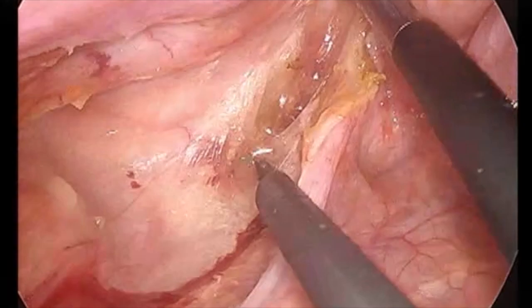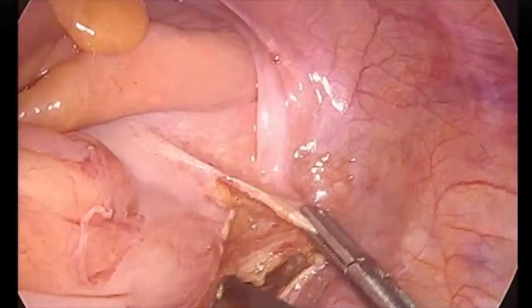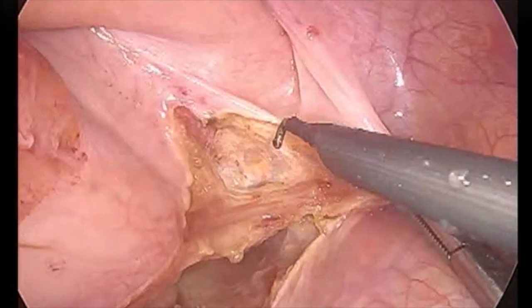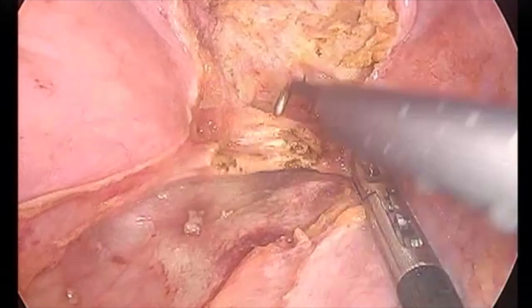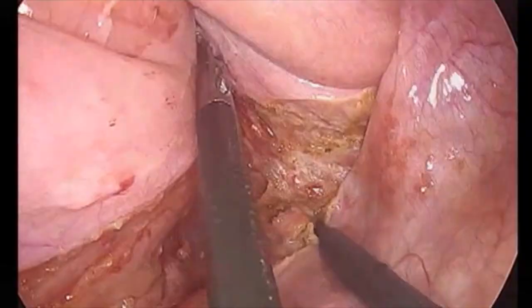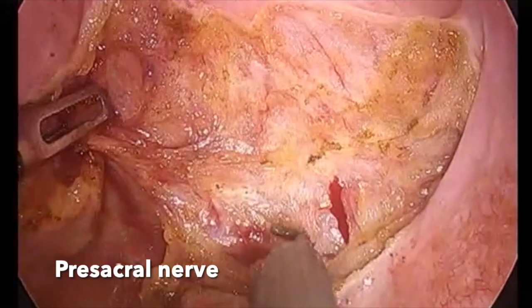You can also use harmonic shears for this part of the dissection. Dissection is continued until you reach the coccyx and the pelvic diaphragm is exposed. Once the posterior dissection is completed, we perform the right lateral dissection and the lateral ligaments are divided. We have to ensure that we divide the lateral ligaments close to the mesorectum in order to avoid the nerves which traverse through the pelvic wall. The dissection is continued inferiorly, and digital examination through the rectum gives us the idea of the inferior border of the dissection.